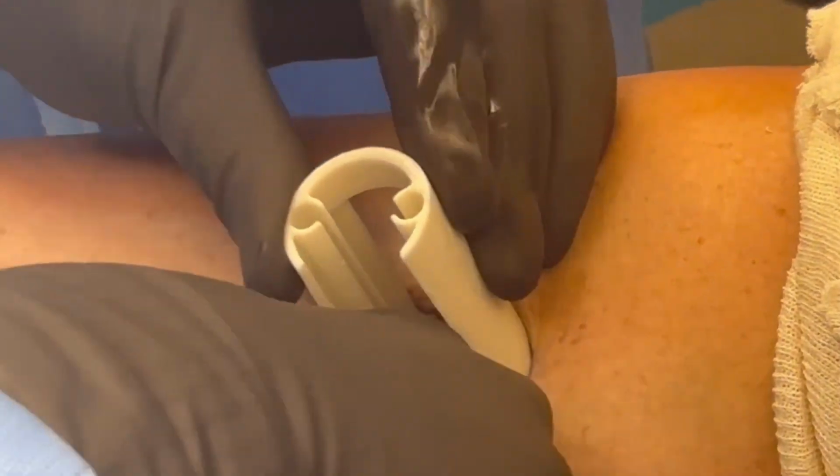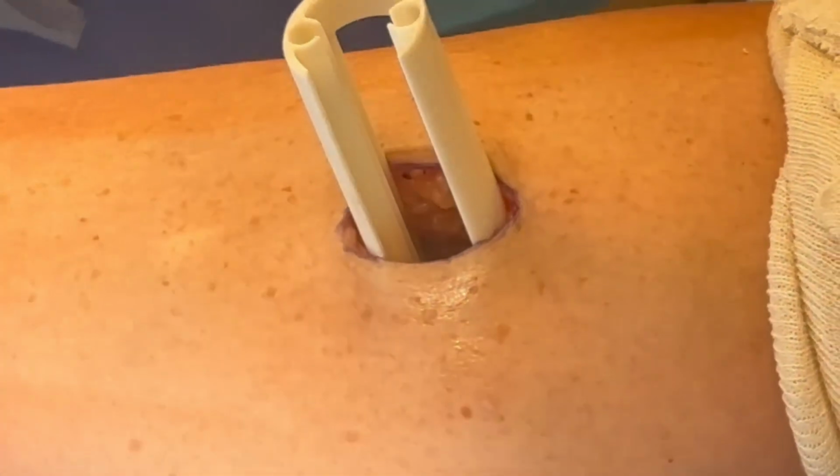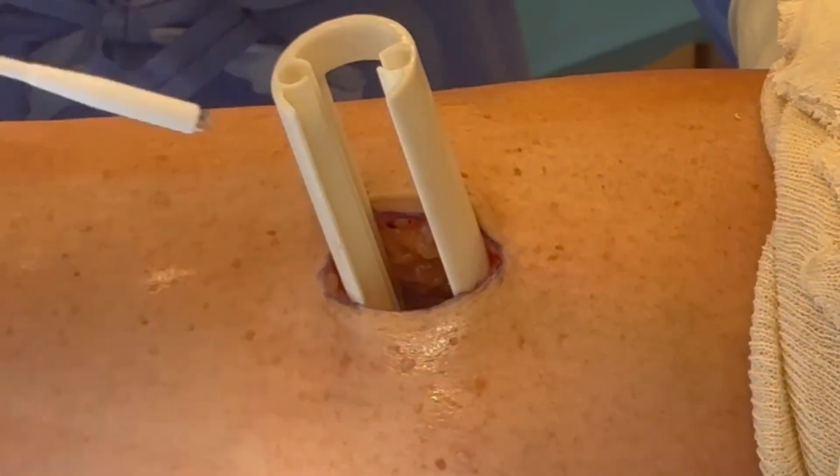And we're going to take this out and use the Baumann Gastroc Recession system to help open the surgical site and provide illumination intraoperatively. So here's the cannula that's going in between the gastroc and soleus. You want to make sure you're all the way across to the far lateral side. You have plenty of length on the cannula to get all the way across laterally.